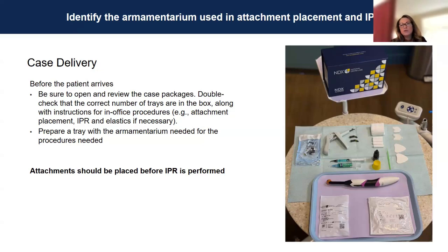I tell them that we're slenderizing the tooth a little bit and polishing it. That way they don't freak out when you say, yeah, I have to remove 0.1 between number 24 and 25. It's like, oh no, you're going to be taking some of my tooth structure off.